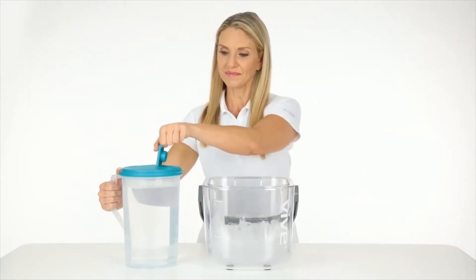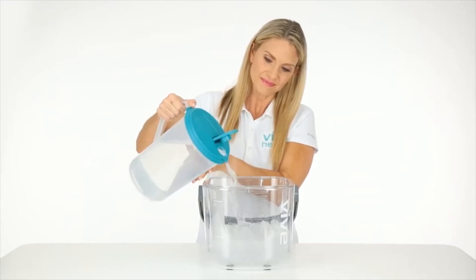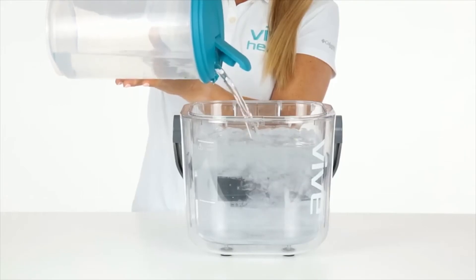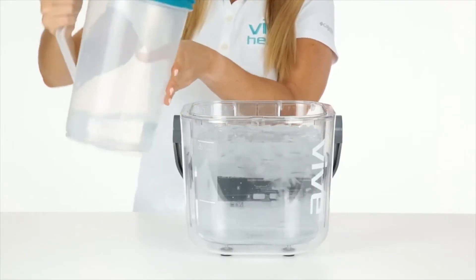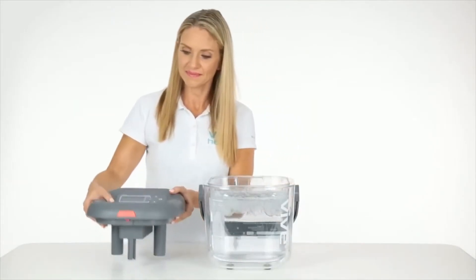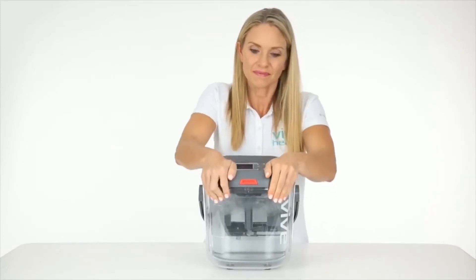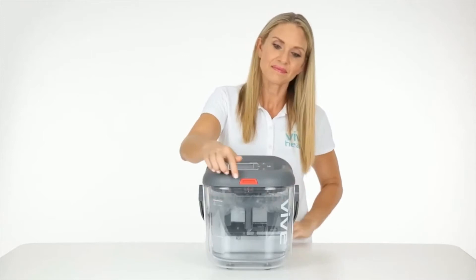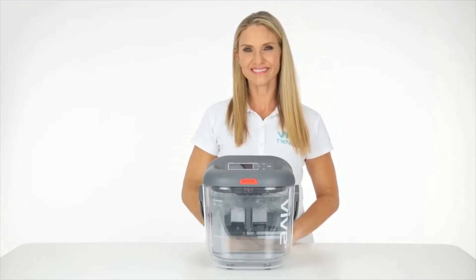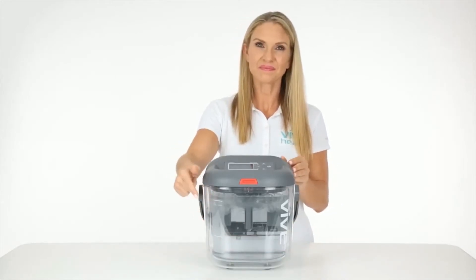Next, add cold water to the bucket, making sure that it reaches the top of the water fill line. To attach the lid, tilt the lid into the grooves of the bucket. Make sure that the clasp is securely latched at the front of the bucket. If the tubes on the lid don't reach down into the water, add more ice or water, but do not exceed the max fill line.